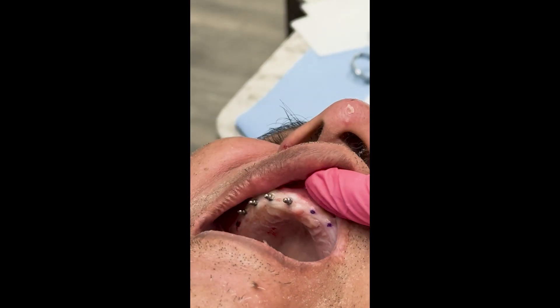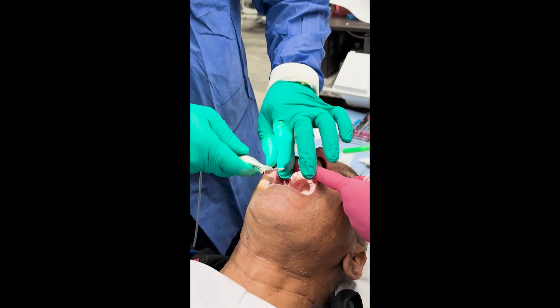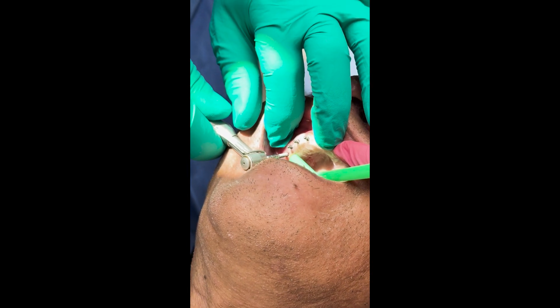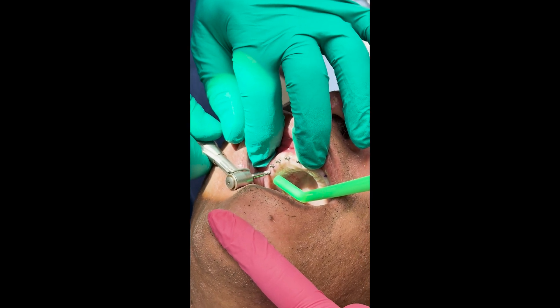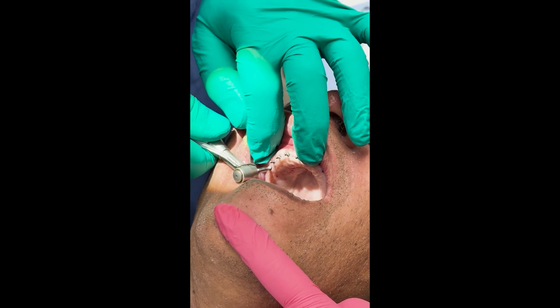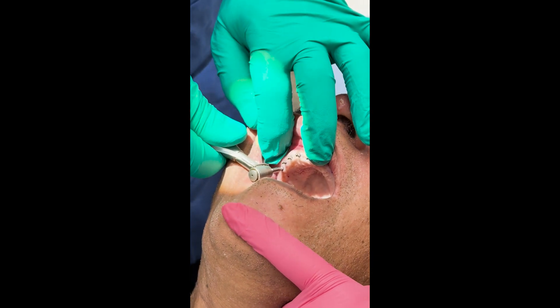And we're going to put the last implant in on this side. We might consider putting one more, but let's just see how we're doing with the 10 — I think 10 will be plenty. As you get more posterior, the bone does get softer, so we may or may not get a beep at this one.